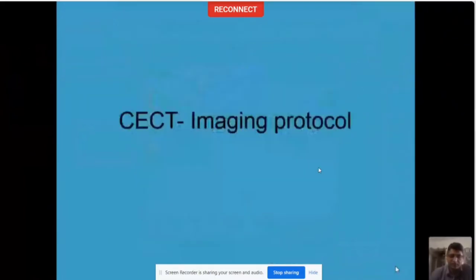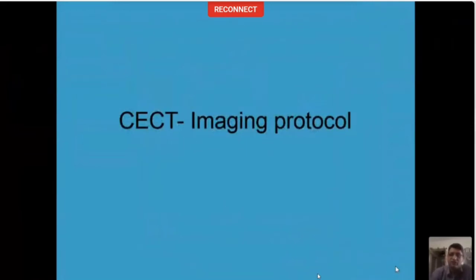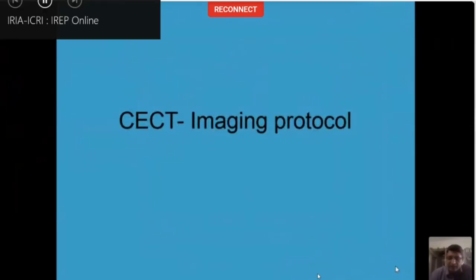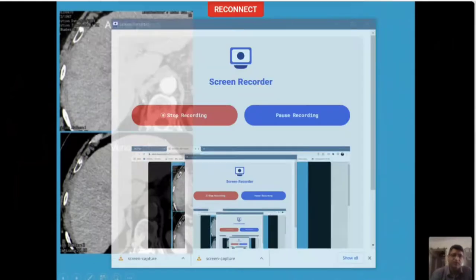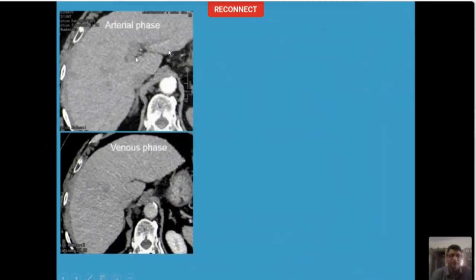For those of you who attended my talk on portal hypertension, I was very particular about very good contrast imaging in the CT scan. It's very pertinent when you are imaging a patient for GI bleed also. Now I will show you an example. This is not a case of GI bleed but of HCC. This particular patient was sent across to us with this CT scan. In the arterial phase you can hardly see anything in the liver. In the venous phase, if you look carefully, maybe at this particular point you can appreciate a focal area of washout. So with this kind of imaging you cannot classify any lesion.